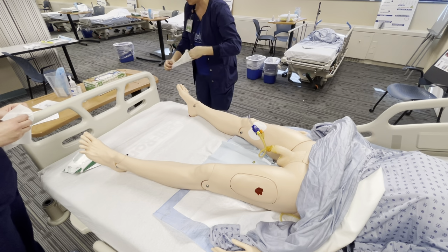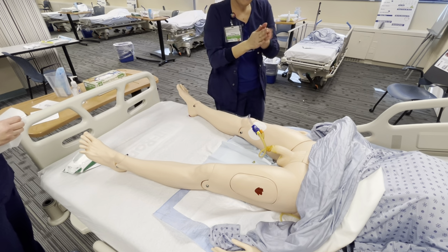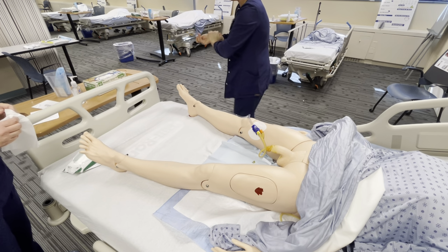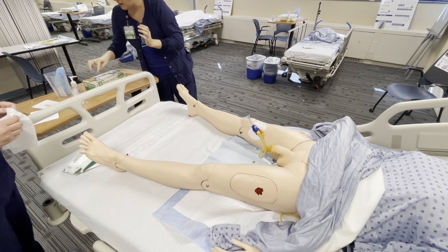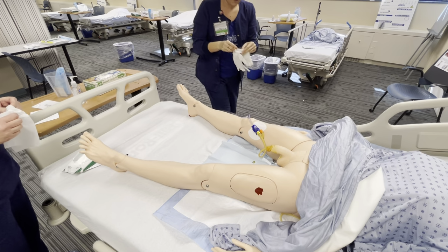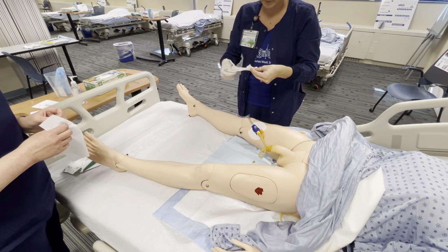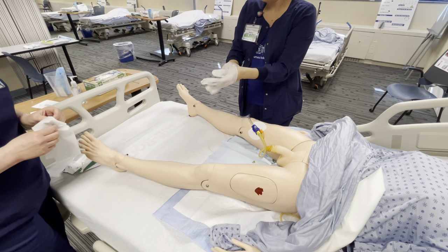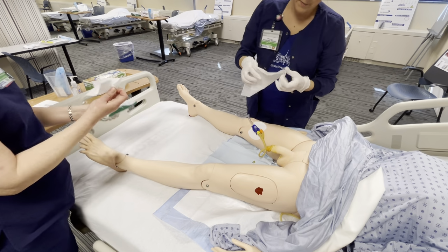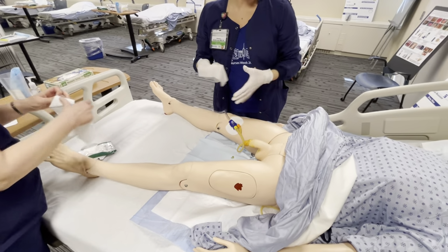We are almost finished, Mr. Gray. We are gonna clean you one more time. So now that you have this catheter in place, sir, we're gonna have to be cleaning it regularly. We're gonna clean it once a shift, after any bowel movement, and as needed. Only your healthcare providers are gonna be cleaning this, okay? We have to use our special wipes. Why do we have to use special wipes? We want to make sure we're preventing an infection. You can get a urinary tract infection if this is not kept clean.